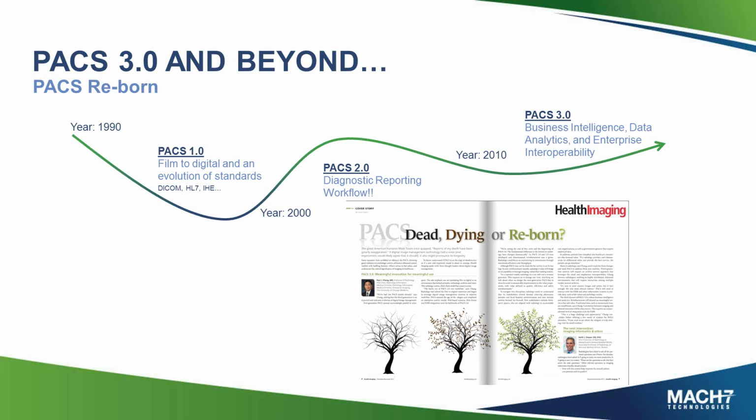But as we came into 2010 and beyond, we're starting to see PACS 3.0, the third generation of PACS, and it's a lot about the business intelligence and the data analytics and the enterprise interoperability around how PACS can communicate and how you can get the data out of it. Especially with how payer systems are changing, those analytics are becoming more and more important. And although we will always need to continue to push on the visualization side of PACS, the picture system, we always want to provide that. At the end of the day, we're all here to diagnose a patient and provide the best patient care. But you'll see in PACS 3.0, there's a lot of emphasis on the back end and the data and how we manage the data.